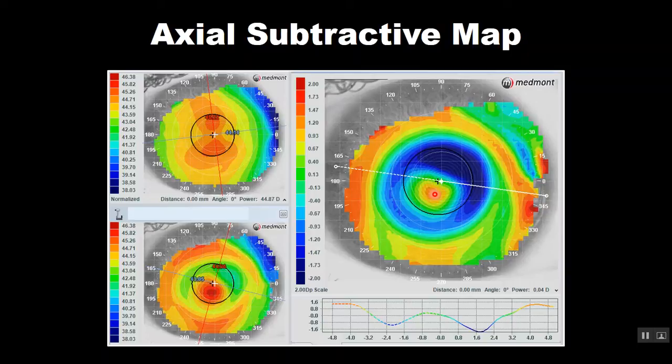We've steepened the cornea up. At times, when there's some central corneal staining, some of that mild grade 1 staining that we often see after one night in Ortho-K, the disruption in epithelium will create a disruption in the placido reflection, the ring reflection, and we get a false central island. So if the vision is improved, it's probably a false island, and you should just wait it out. Let that patient wear the lens a few more nights and confirm that you've got the bullseye. But if the vision is much poorer with the spherical overrefraction, if your best corrected VA is down quite low, then you know that that's a real island.